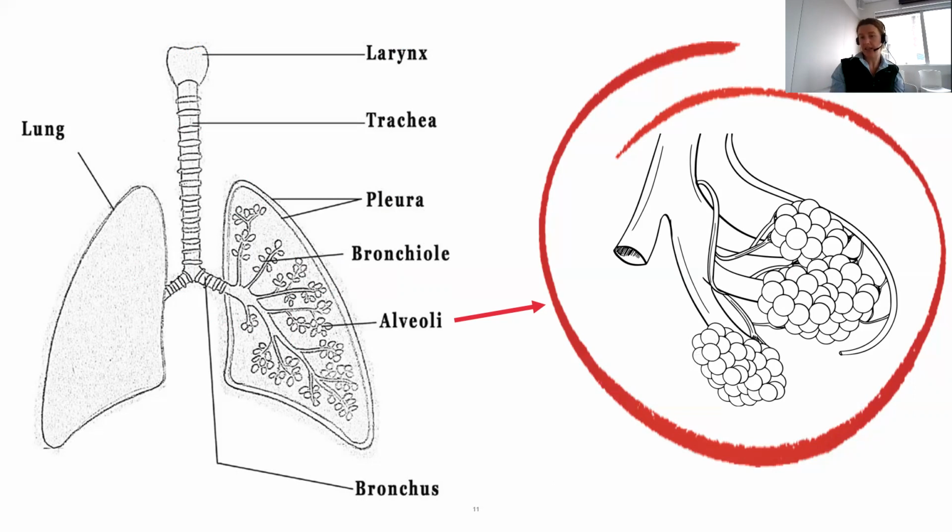The other big advantage is that it helps us push things like fluid back into the circulation. So when we apply a positive pressure in a condition such as pulmonary edema, if we give someone CPAP or some PEEP in pulmonary edema, that's how we actually get the fluid from their lungs back into the circulation. We essentially just push it back into the circulation.